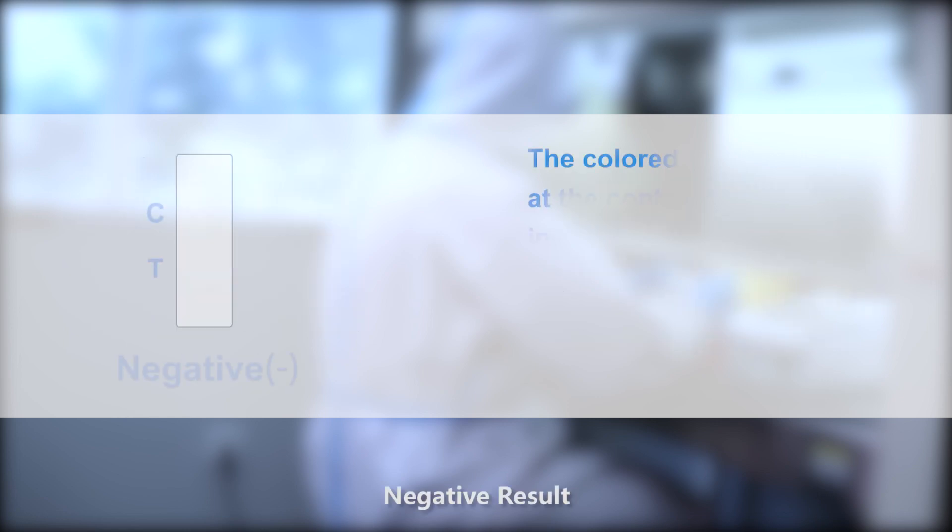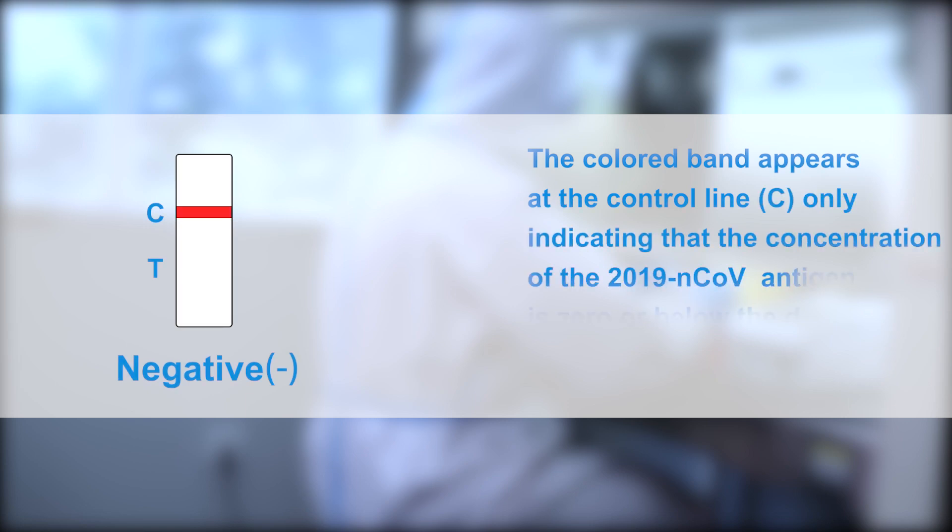Negative results: The colored band appears at the control line C only, indicating that the concentration of 2019 novel coronavirus antigen is zero or below the detection limit of the test.